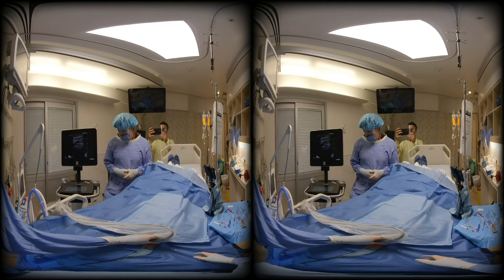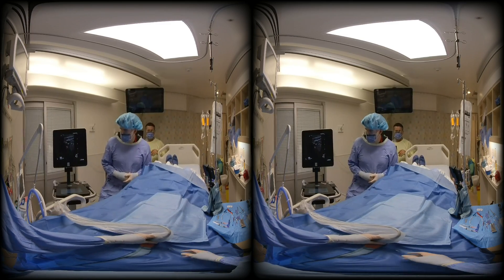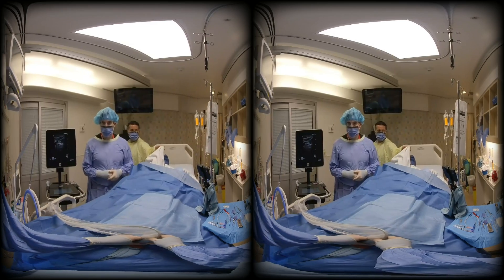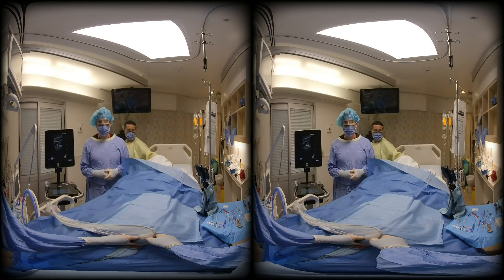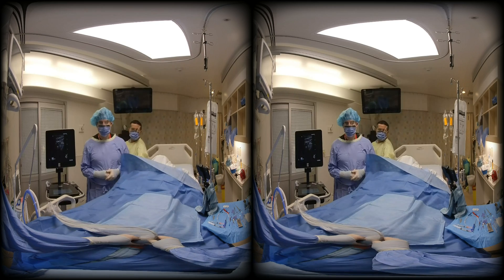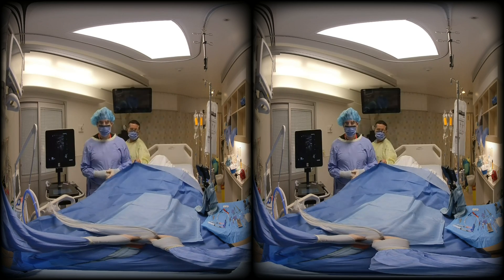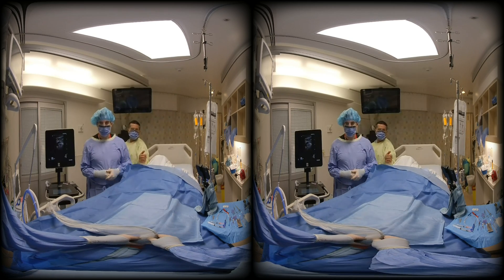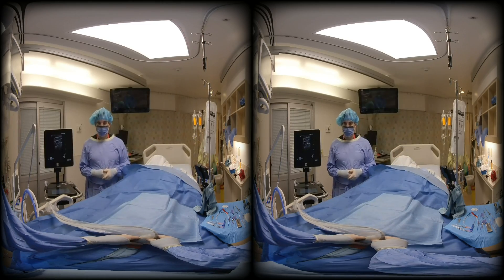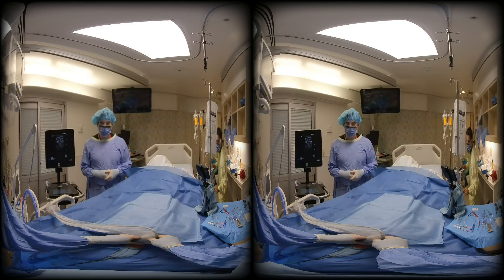Generally speaking, the carotid will be medial and the IJ will be lateral. The IJ is usually highly compressible. There may be some pulsatility in close proximity to the carotid. Make sure your orientation screen marker is positioned correctly to correspond to the patient anatomy.